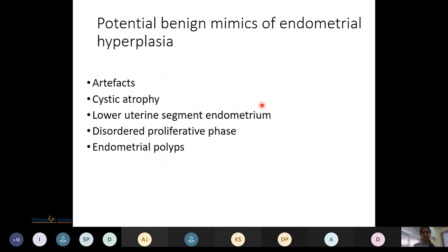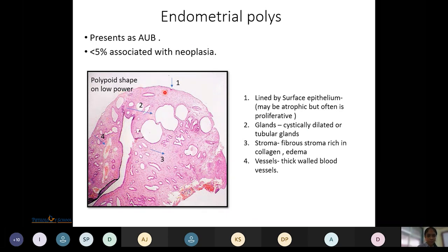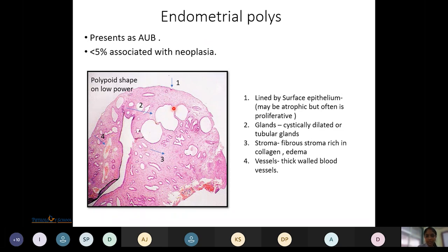Benign mimics of endometrial hyperplasia include artifacts, cystic atrophy, lower uterine segment endometrium, disordered proliferative phase, and endometrial polyps. Endometrial polyps most commonly present as abnormal uterine bleeding; less than 5% are associated with neoplasia. On low-power view, polyps show a polypoid shape with surface epithelium that may be atrophic but is often proliferative. Glands are cystically dilated and some are tubular; stroma is fibrous, rich in collagen, with some edema, and thick-walled blood vessels are an important identifying feature.